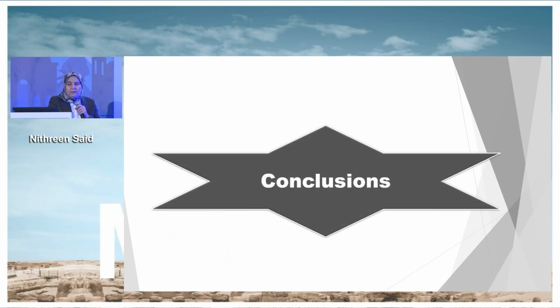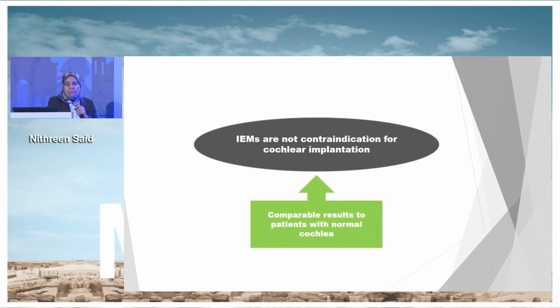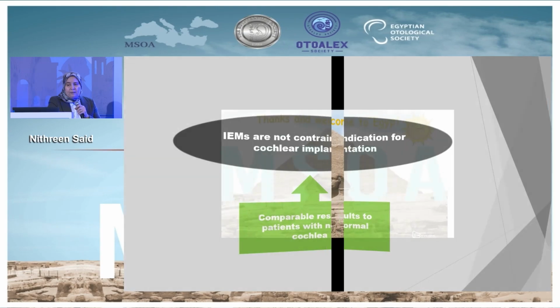So to conclude, in spite of the challenges, inner ear malformations are not a contraindication for implantation, and they can give results comparable to patients with normal inner ear.